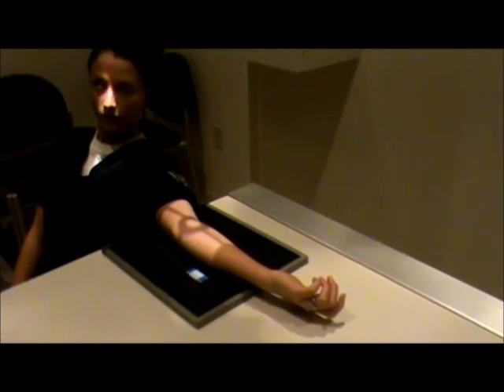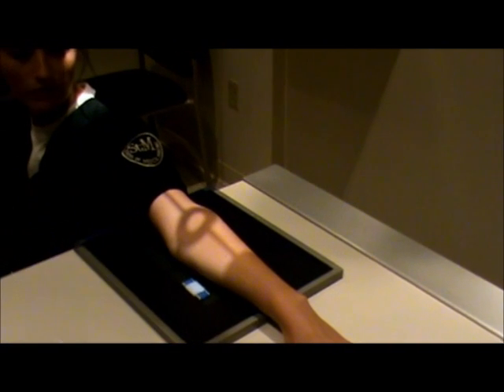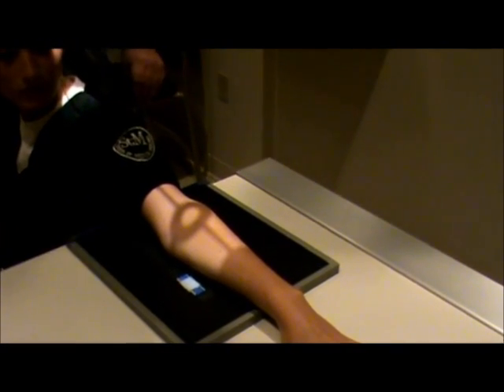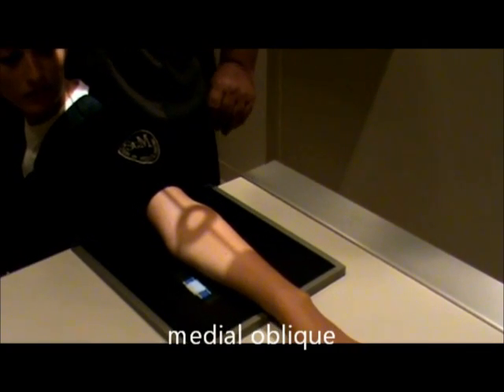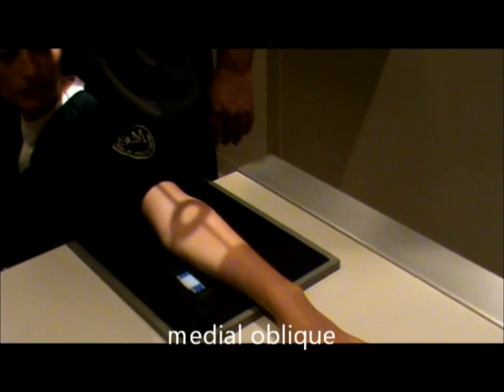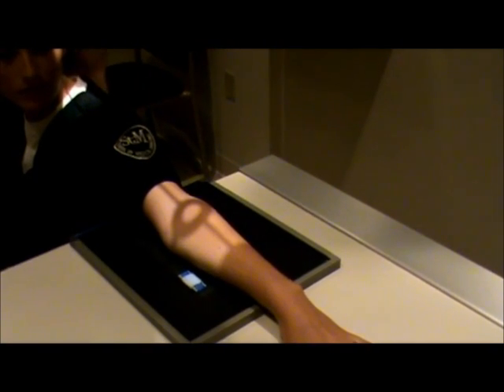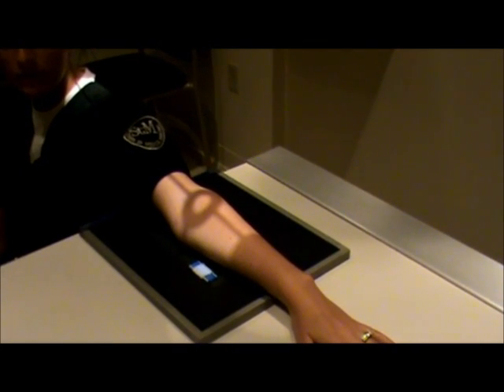We also can do a medial oblique elbow where we turn the hand until the palm is down, again staying in the center of the film. This is a medial or internal oblique elbow. This view will best demonstrate the coronoid process and the trochlea in profile. Technical factors remain the same: 8 mAs at 55 kV.